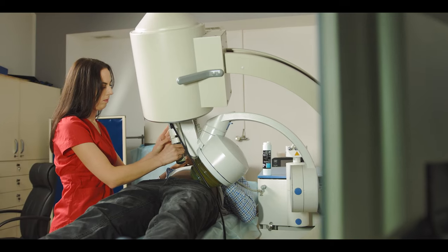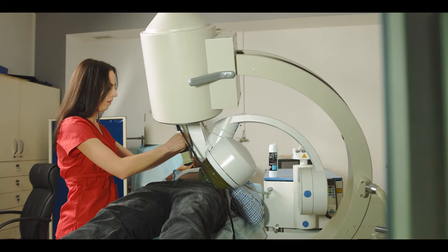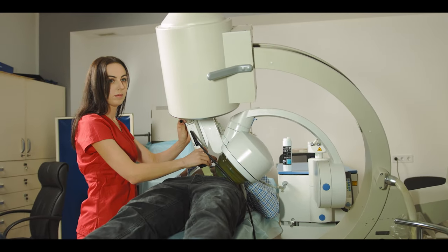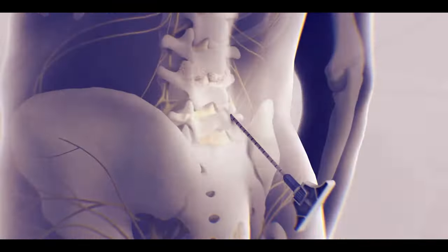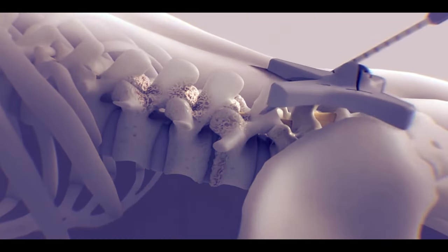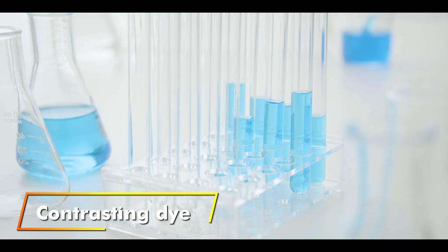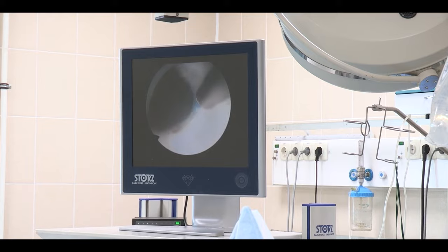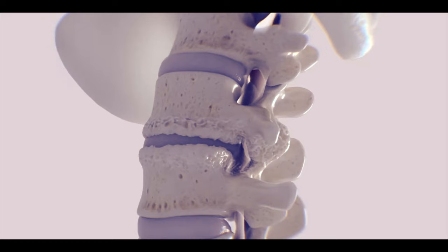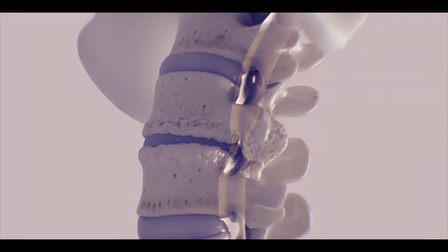The surgeon uses a special x-ray device called a fluoroscope to visualize the spinal canal on a video monitor and inserts a thin needle through an incision in the skin into the spinal canal to inject contrasting dye. Contrasting dye is a chemical that binds with the spinal canal tissues to create a clear image on the video monitor to identify compression in the spinal canal.